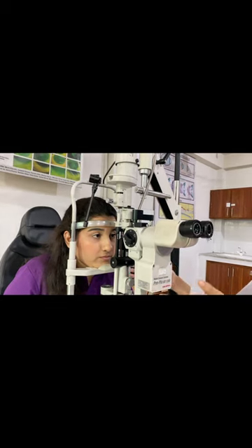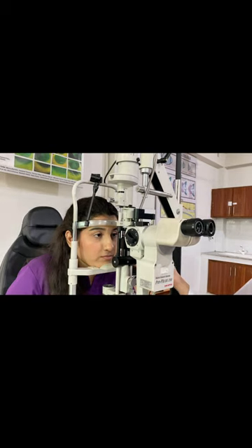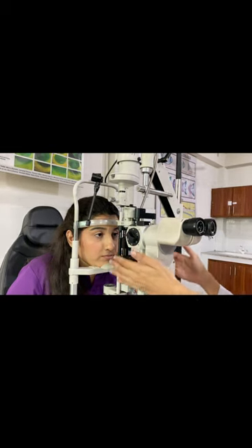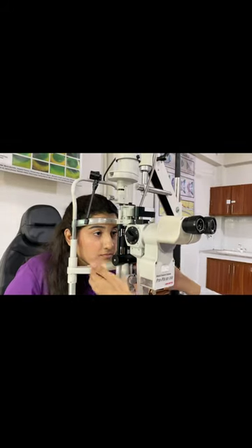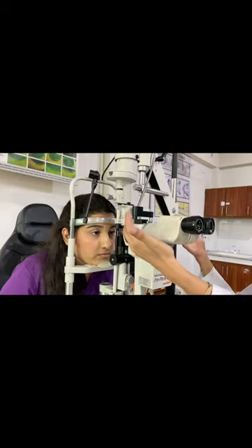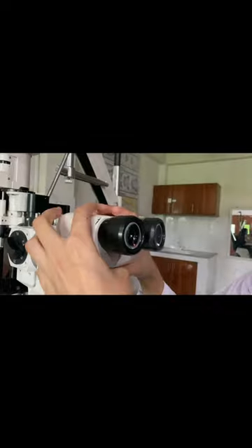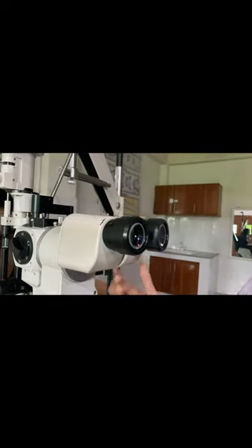In a patient who is having dry eye syndrome, the first step is to perform the mechanical adjustment for the patient so that we can perform this procedure more easily and have the exact measurements for the test. Our second step is to do all the adjustments for the observer.